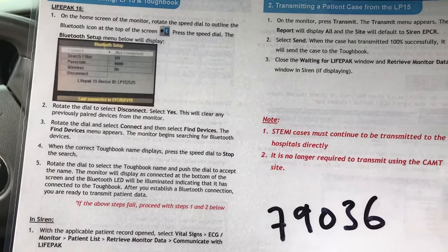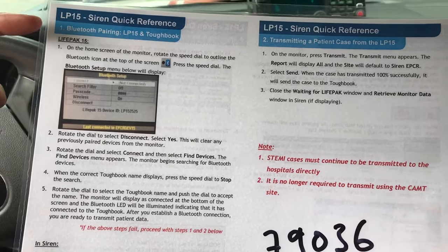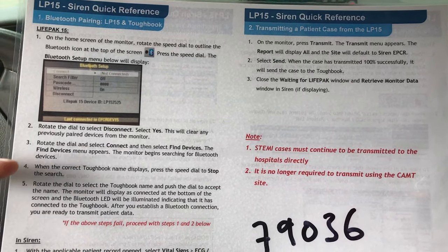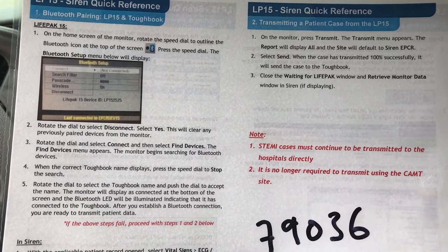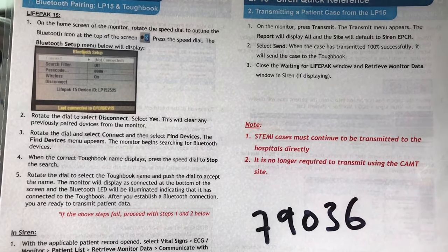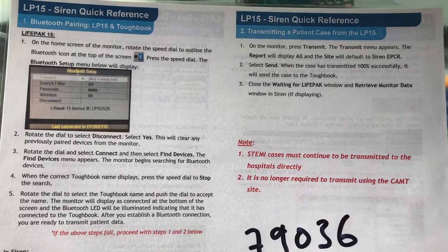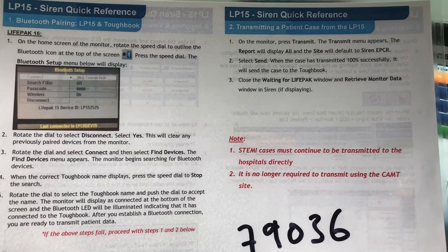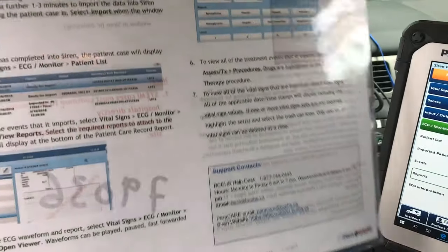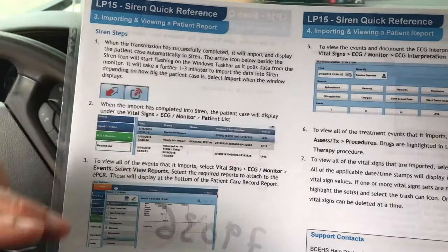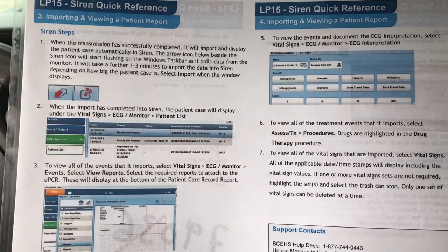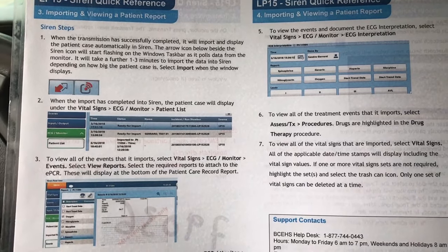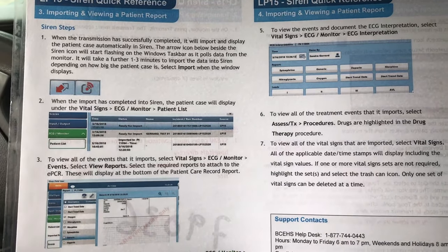This is a great quick reference guide. Page one is the pairing I've showed you how to do. There's an alternative way if you have a challenge pairing from the LP-15 — you can pair from Siren. The transmission quick reference is an easy thing to do. And on the back side, this helps you navigate through Siren and pull up your fields once you've downloaded from the LP-15.